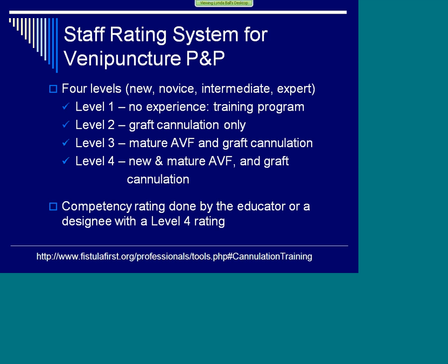So you're still given an order about how to start, or your policy and procedure should still describe that you start with a 17-gauge needle at a 200 or a 250 blood pump speed. And if you can successfully do that with new patients, then you become the expert cannulator, and that means you can cannulate all of them. The level 4 should also be those complicated accesses, the ones that require multiple sticks on a pretty frequent basis. Those should be reserved for expert level cannulators as well.